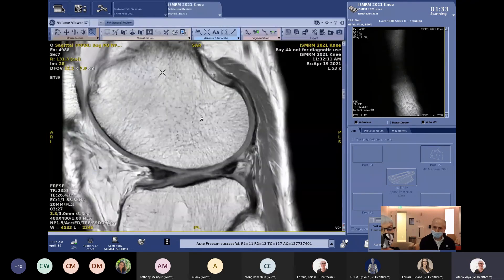All these features we're showing today are part of the latest software. SignalWorks AIR IQ Edition is a new software with a lot of different features: the ability to do Hypersense on T1s, Hypersense on merges — great for customers interested in musculoskeletal imaging with Merge or Mensa, applying Hypersense to 3D volumes with much shorter scan times thanks to compressed sensing. There are also other features, including bringing diffusion-weighted imaging in. It's really strong — a lot of different software packages come together in it.